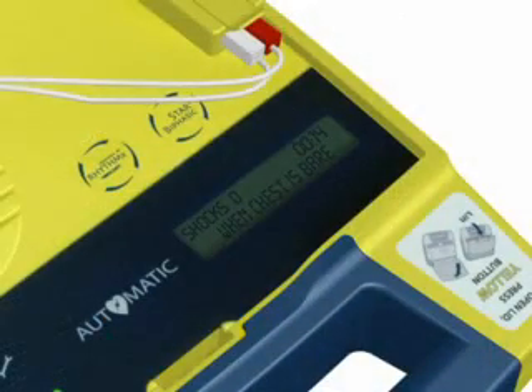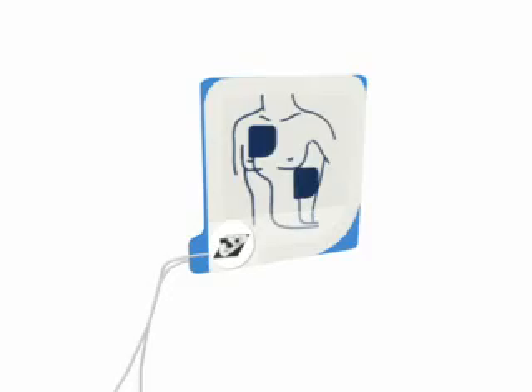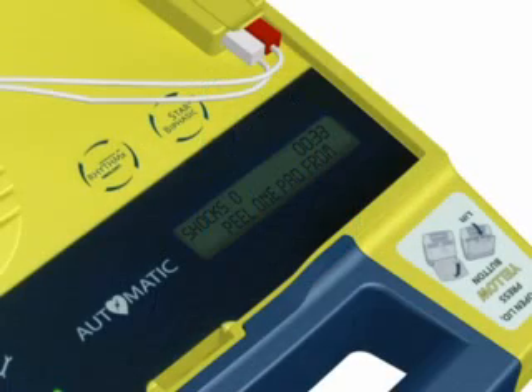When the patient's chest and torso are exposed, remove the square foil package from the lid of the AED. Tear open the foil package across the dotted line and remove the pads. Separate one of the white pads completely from the blue plastic liner, beginning to peel from the tabbed corner.